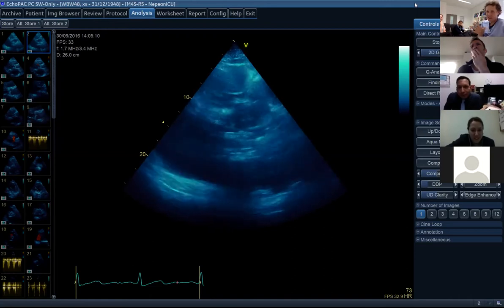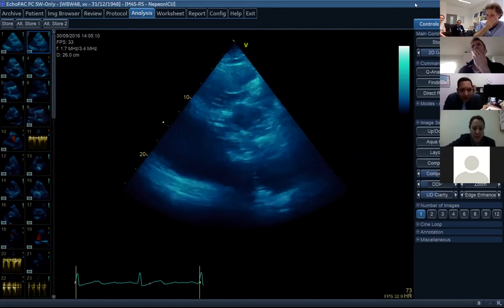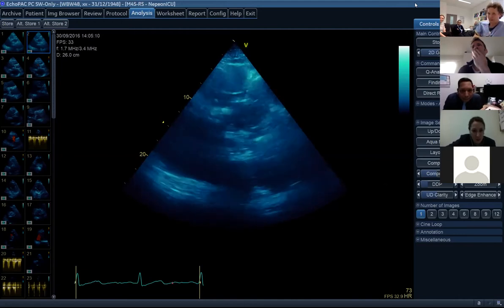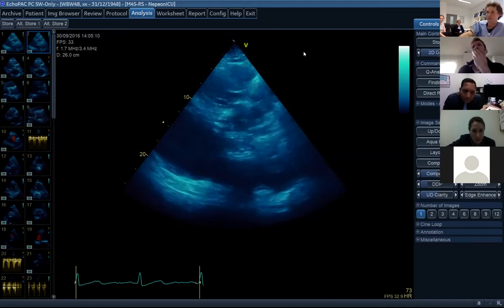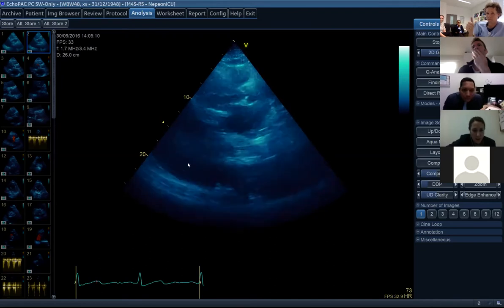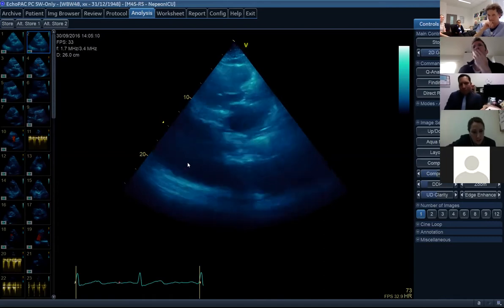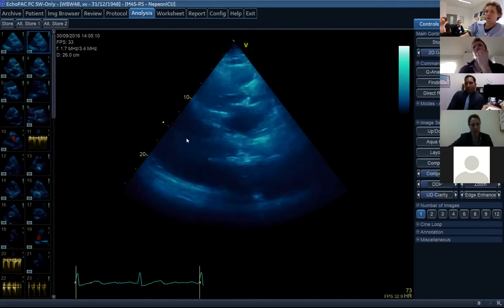So right. This is just failed extubation, getting re-intubated. I think what we are looking at here is a zoomed out view with a lot of depth of a parasternal long axis. Because what I can see is the RVOT anteriorly there with the LV, the LA, and then behind this a large echo-free area, which I think is likely to be a large pleural effusion. I think that the echo-free area is lying behind the descending aorta, which would make it a pleural effusion rather than a pericardial effusion. Beautiful.